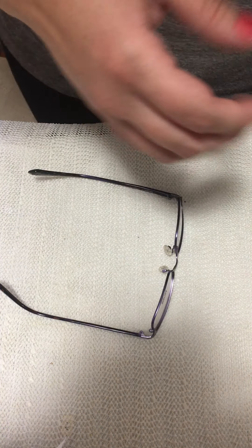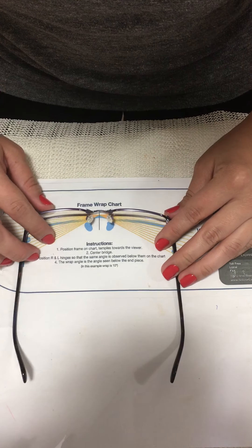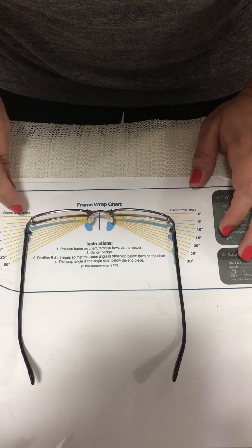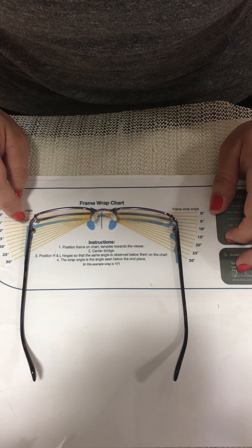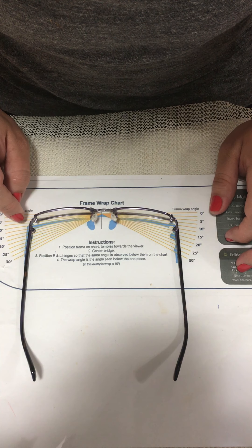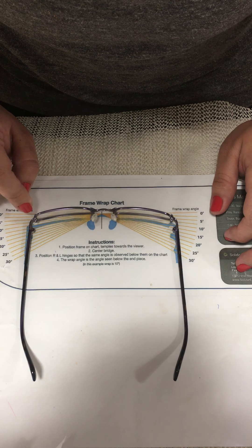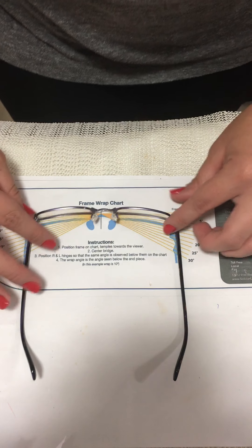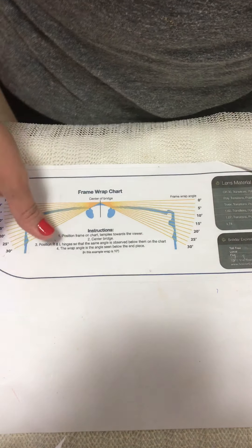The frame still has pantoscopic tilt, which all frames should have, but not as much as before. I'll use my chart to check the pantoscopic tilt. It now has approximately 10 degrees more or less. That is the pantoscopic tilt misalignment correction — too much pantoscopic tilt.